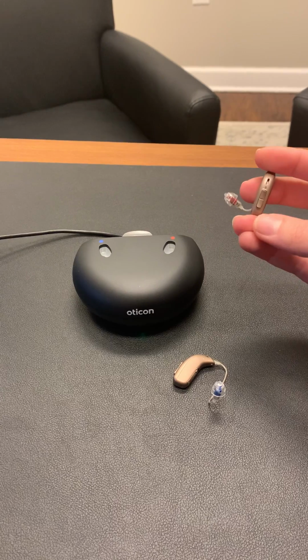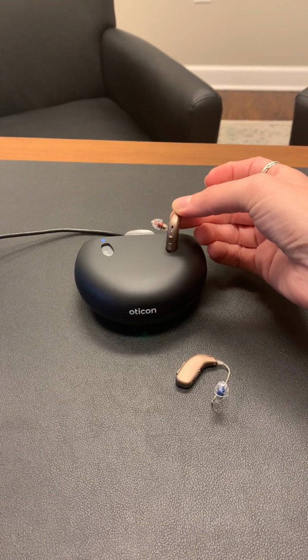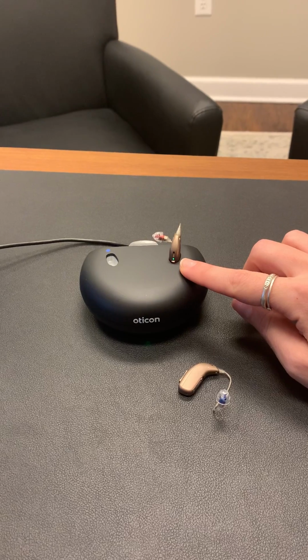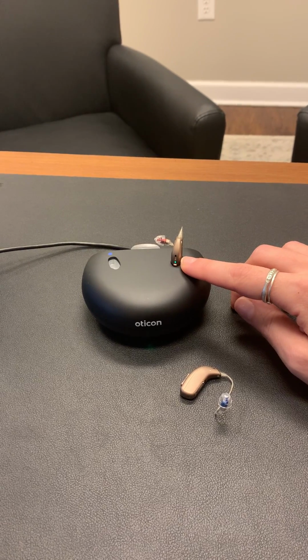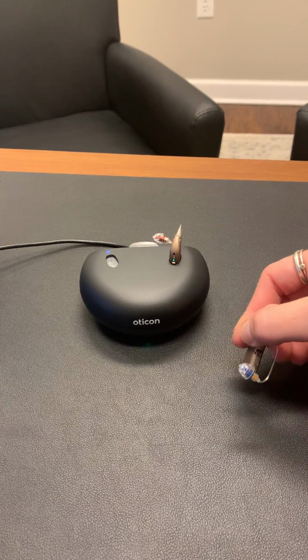So what you're going to do is you're going to put the hearing aid into the charger just like this, and you will see that it starts to blink red until it is fully charged. These hearing aids right now are fully charged, so as soon as they go into the charger, they will turn solid green. We're going to do the same with the blue device, which is your left device.